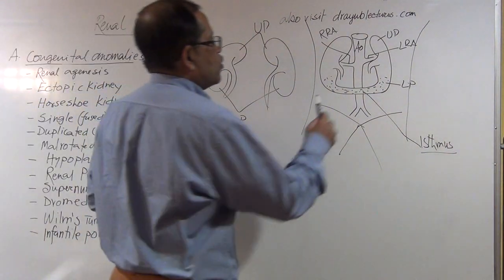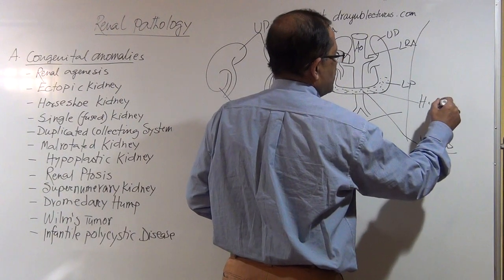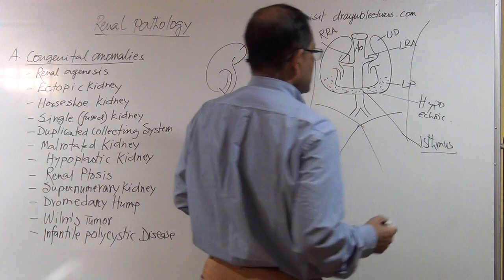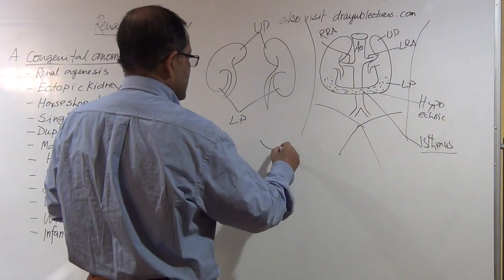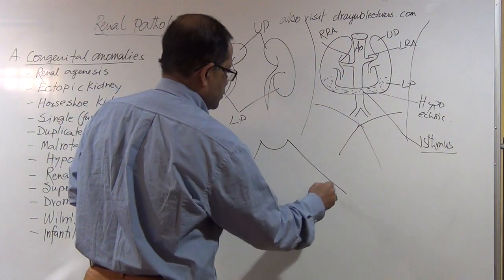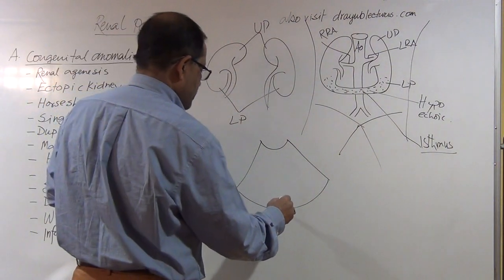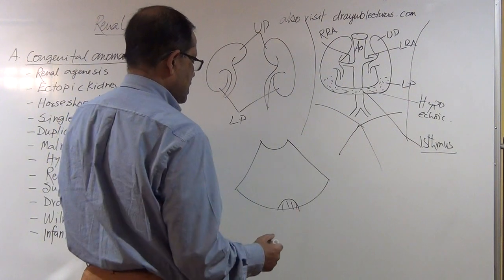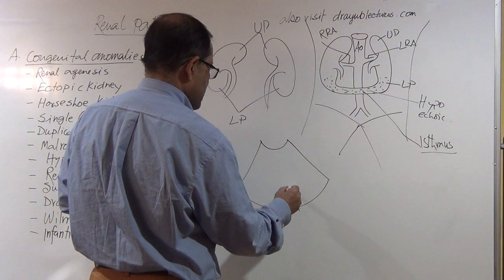Cortical. And cortical looks hypoechoic, we know that, right? Hypoechoic. So sonographically, what you are going to see, look at here. Sonographically, in transverse view, you will see this is the spine, and you will see this is the aorta.